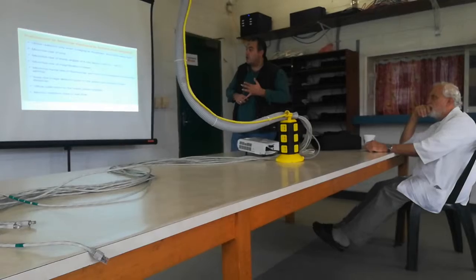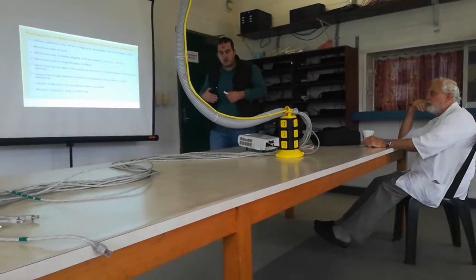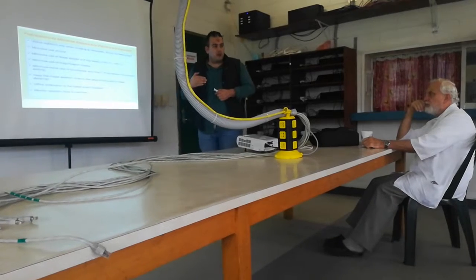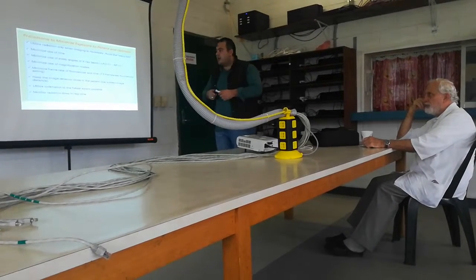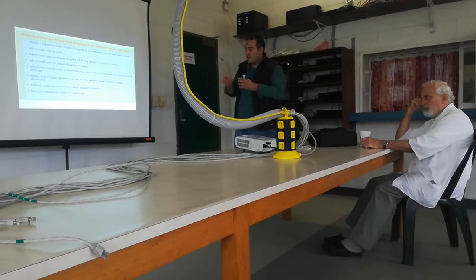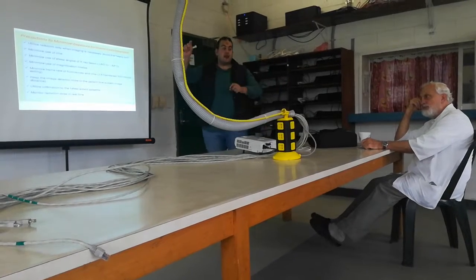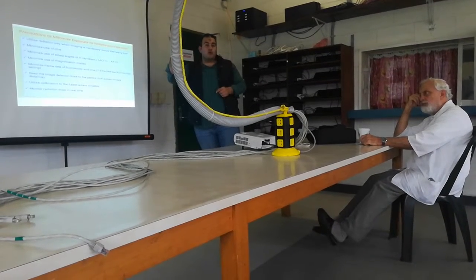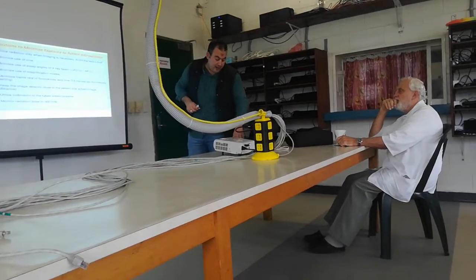Minimize frame rate for fluoroscopy and cine, 7.5 frames. You have to reduce the pulse rate; a lower frame rate will be good for the patient and for you. Keep the image detector close to the patient. Utilize collimation to the fullest extent possible. Monitor radiation dose in real time. You have to see the dose of the patient on the monitor every time.